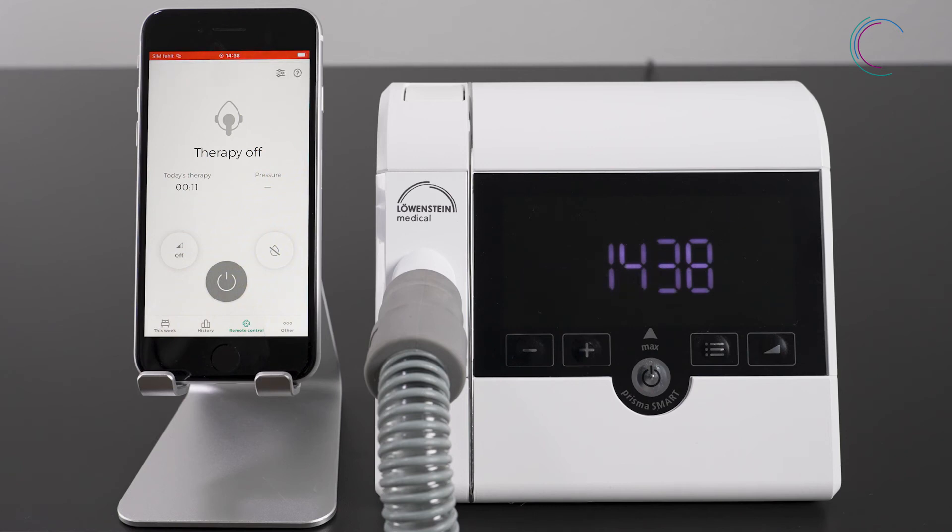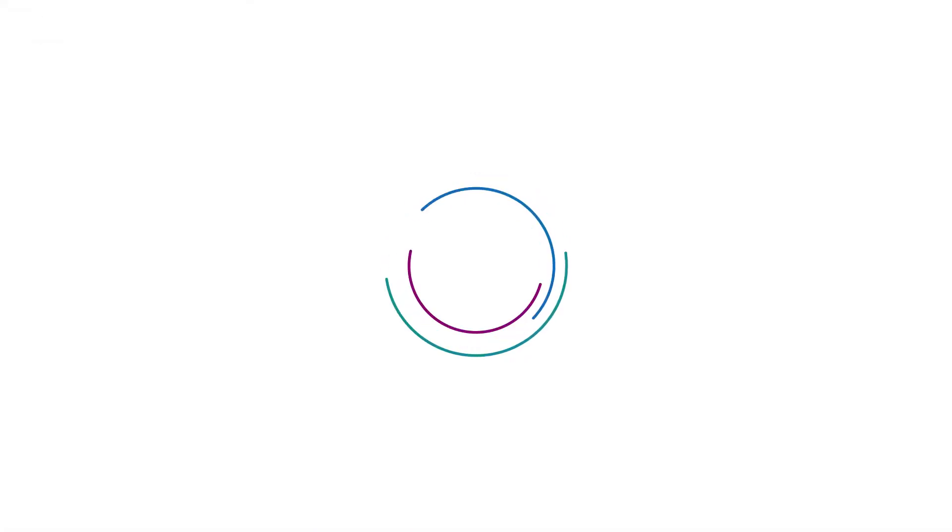Now you can start your therapy. And now have fun with Prisma App.